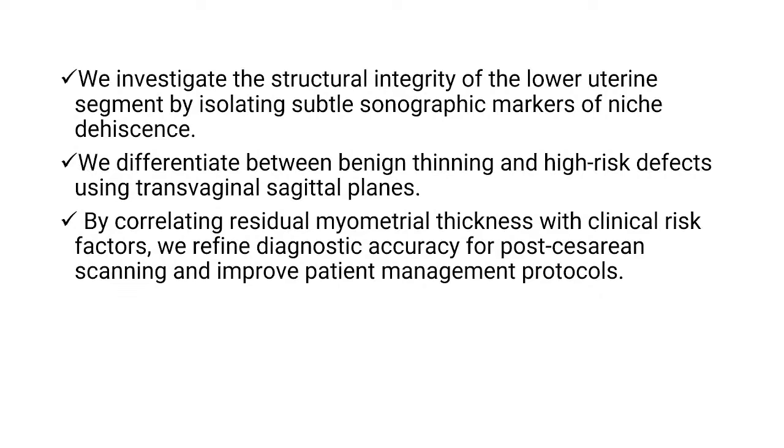So we investigate the structural integrity of the lower uterine segment by isolating subtle sonographic markers of niche dehiscence. We differentiate between benign thinning and high-risk defects using transvaginal sagittal planes. By correlating residual myometrial thickness with the clinical risk factors, we refine diagnostic accuracy for post-cesarean scanning and improve patient management protocols.